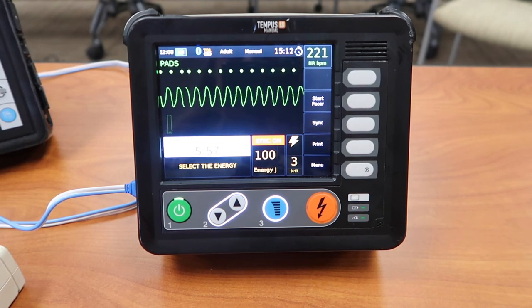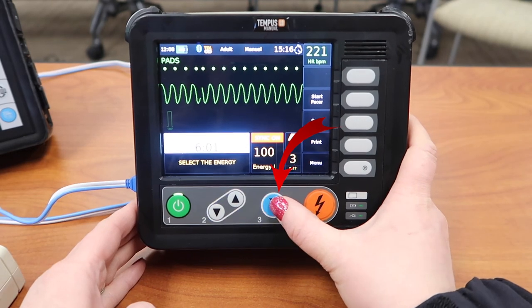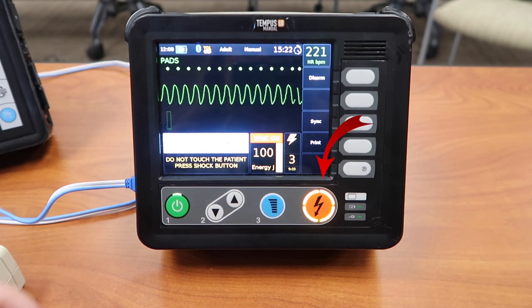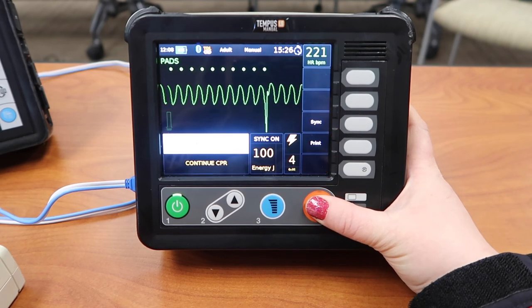And in order to charge it, you have to press that blue button on the bottom. By pressing that blue button, you'll immediately start to see it charge on the screen. And the orange button is completely lit up, so it's ready to shock. Make sure, obviously, everyone's clear, push the orange button down and hold it until the shock is actually delivered.